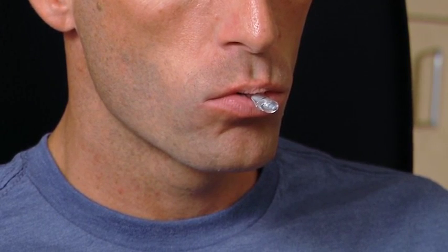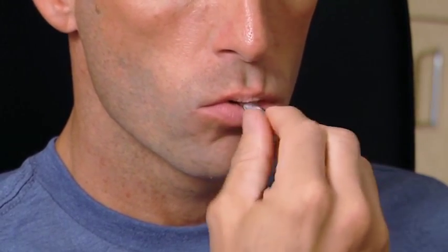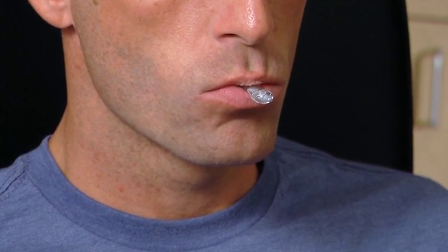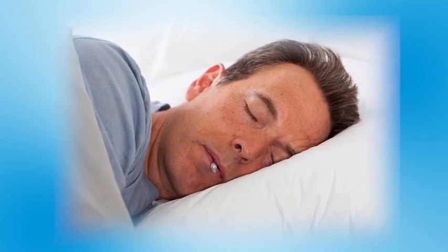To pull your lower jaw forward, turn the adjustment dial counterclockwise towards your left ear. On the first night, start with the myTAP in a neutral, comfortable position or in a position where you normally hold your jaw. Unless your prescriber determines a starting position for you, sleep with your appliance in this position until you are comfortable sleeping with it.